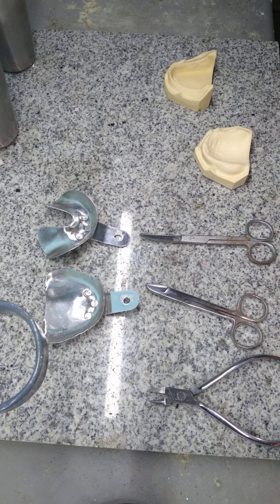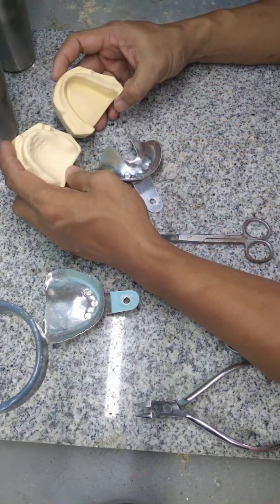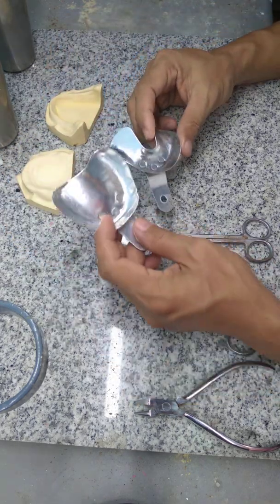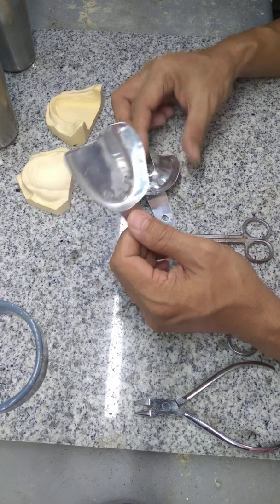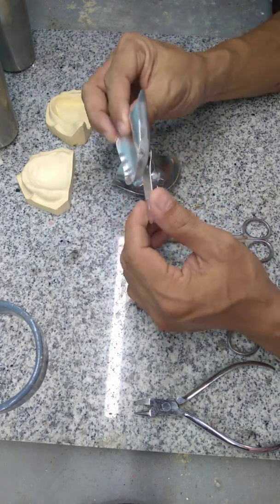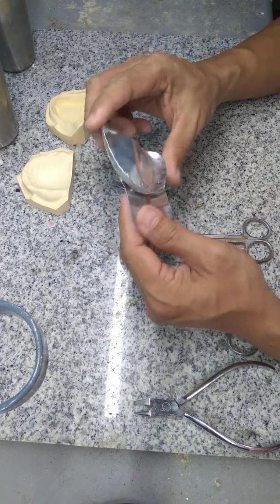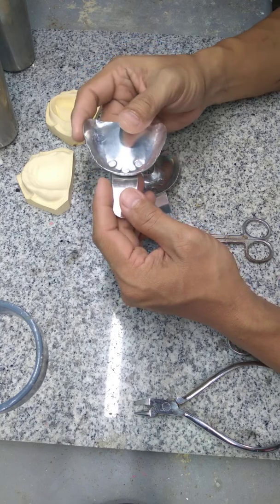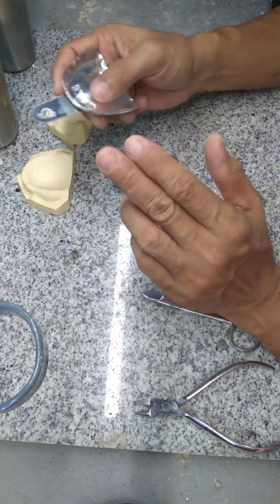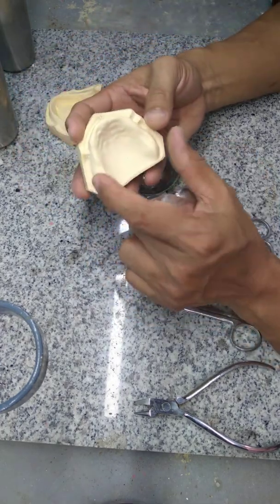These are the things that we need for this exercise. We need a pair of edentulous casts. Stock tray — the stock tray comes in only one size: no small, medium, or large, just one size. Now we need to modify the stock tray. It is made up of aluminum, so we can easily cut, modify, and trim it based on the width of the arch of your patient.